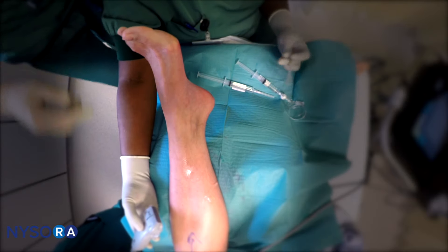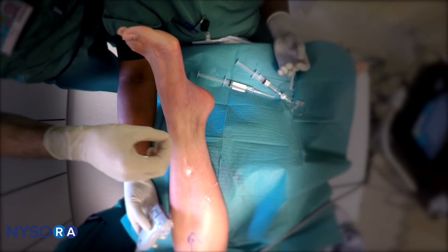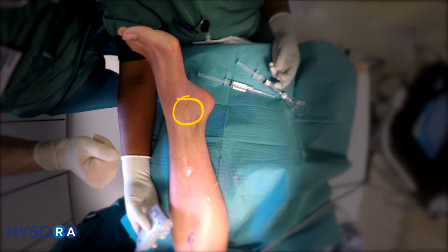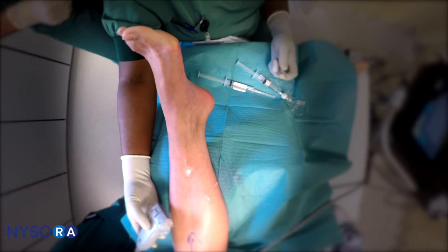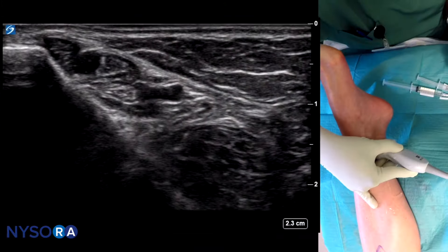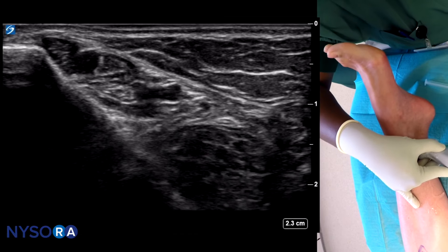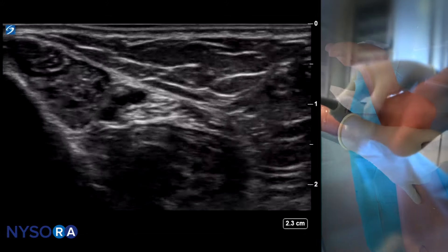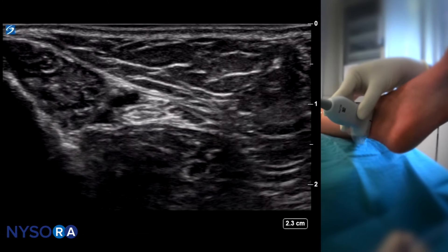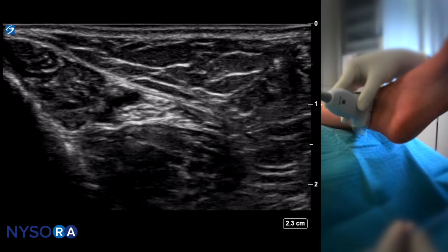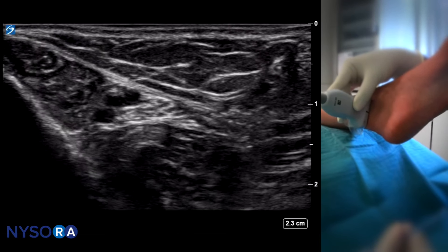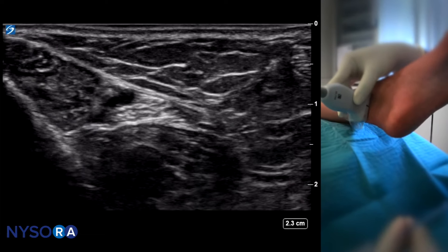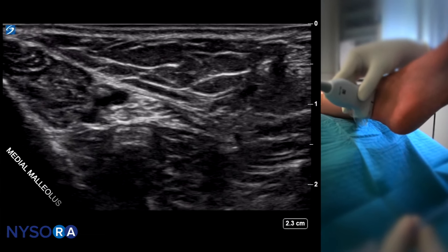Because the tibial nerve is the largest of the nerves we are interested in blocking, we are going to block that first to allow sufficient time for the block to onset. What we are focusing on in the ultrasound image is finding a view where we can see the nerve in its compartment that is conducive for blockade, since nerve block is an injection of local anesthetic into the space that contains the nerve.